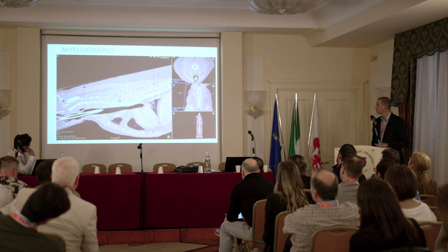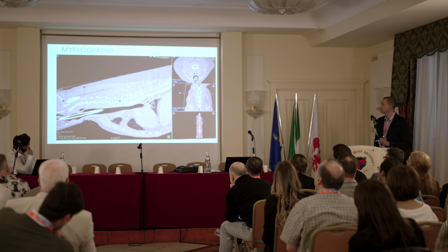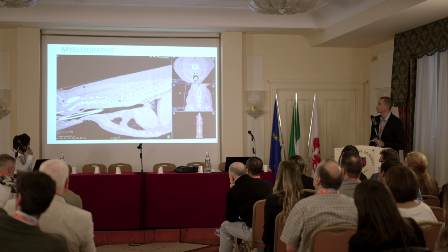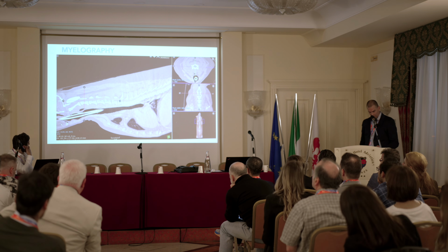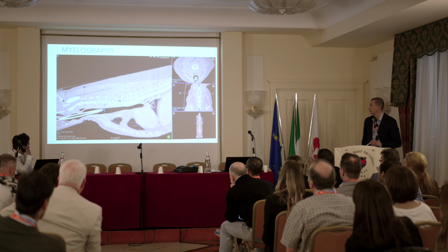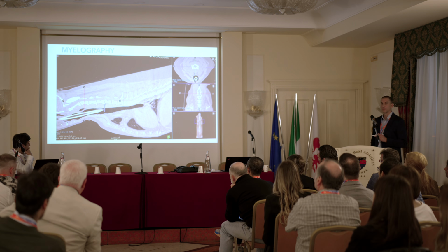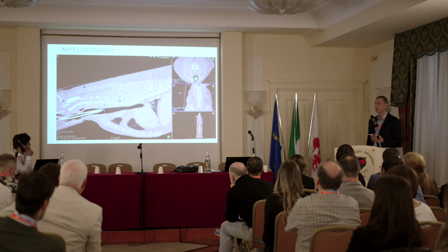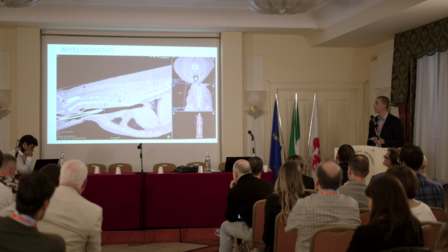But there are, if you know which place you will going to recognize, there are some small pieces of something, and this is 3, 4, 5 here. In this case, the intervertebral space is a little bit narrow, but it's nothing. So the plain native study for diagnosis of this case wasn't useful.